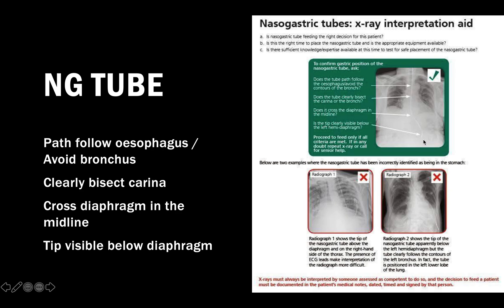In the examples shown: one NG tube fulfills all four criteria; another is off the midline with an unclear tip; another goes away from the midline into the abdomen - and in fact this one is following the left main bronchus and is in the lower lobe of the left lung. That's a catastrophic situation. The tip is still in the chest, not below the diaphragm, because the diaphragm is a dome. All four criteria must be met before starting feeding.